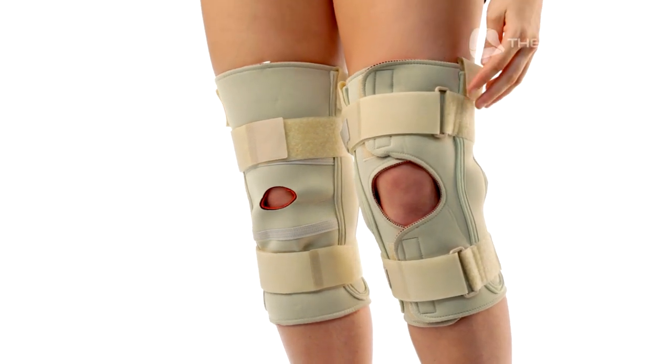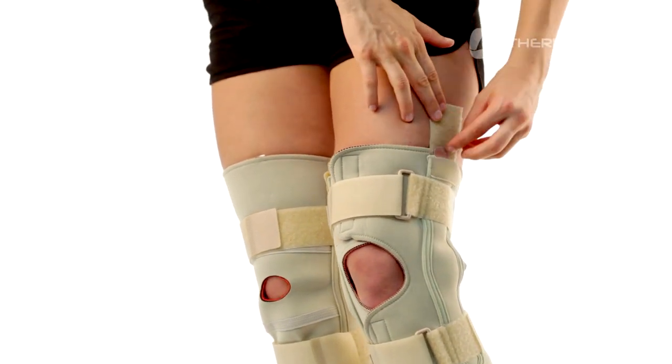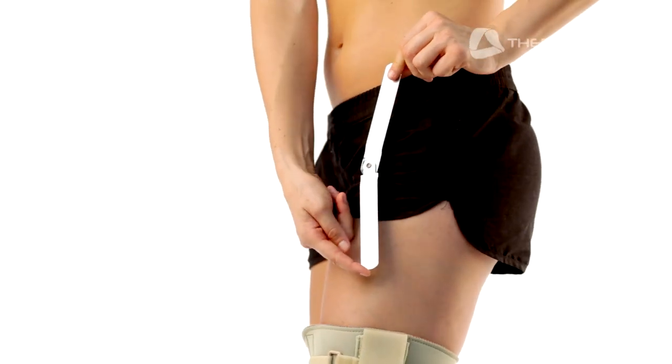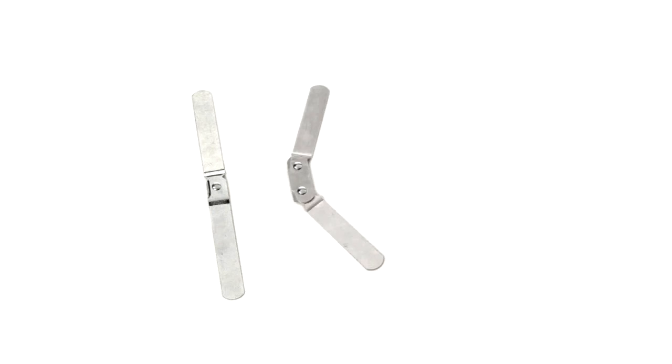The Knee Brace with Sleeve Design or the Knee Brace Open Wrap are purchased with one set of removable hinges. There are three hinge options available: the Single Pivot Hinge, the Dual Pivot Hinge, and the Range of Motion Hinge.